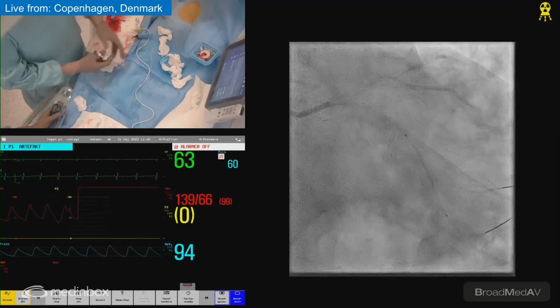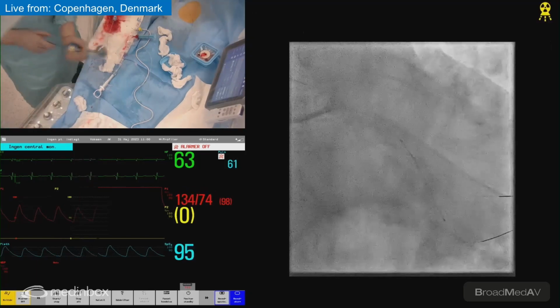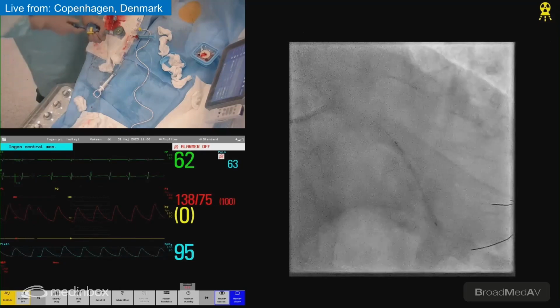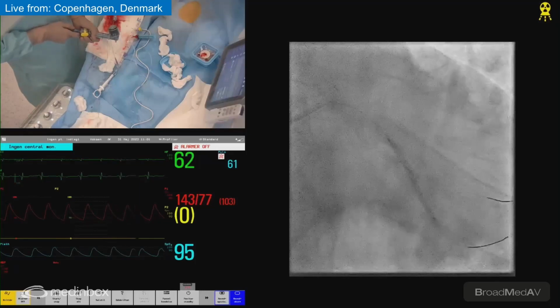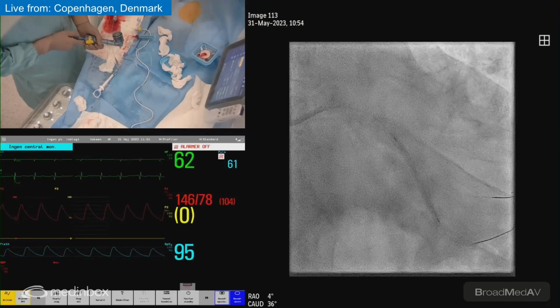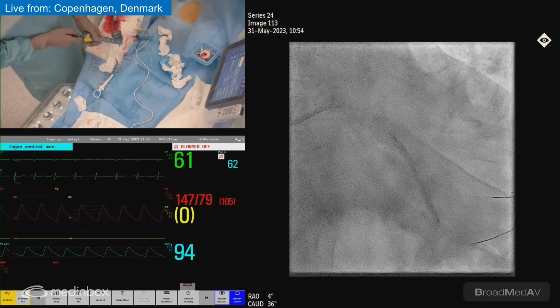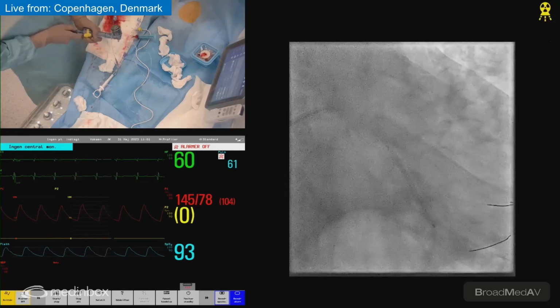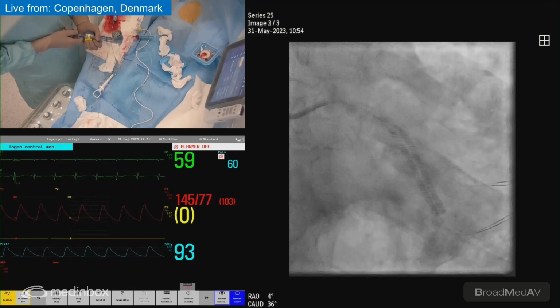Yeah, that's exactly the point where we wanted to put it. So we'll bring up the stent. And remember, it was only 2.6 or something in the distal part. So 10 atmospheres at this point. And then we go down afterwards with the post-dilatation and IVUS control and see whether it needs further. But as I said, the reference diameter was about 2.6 at the distal part.